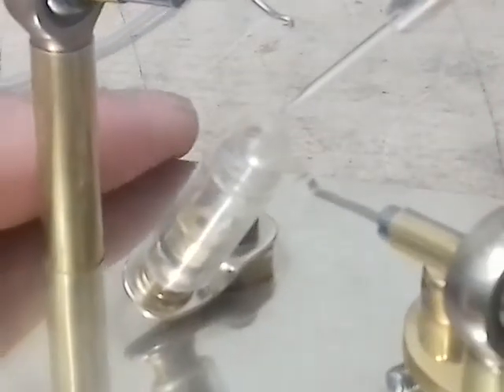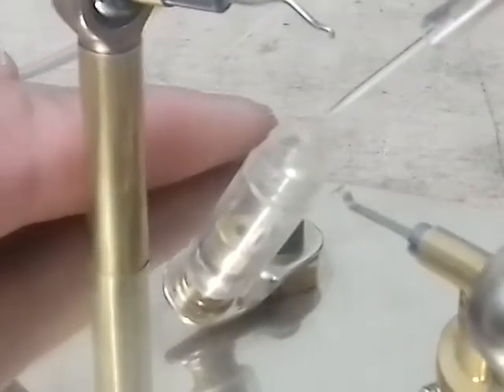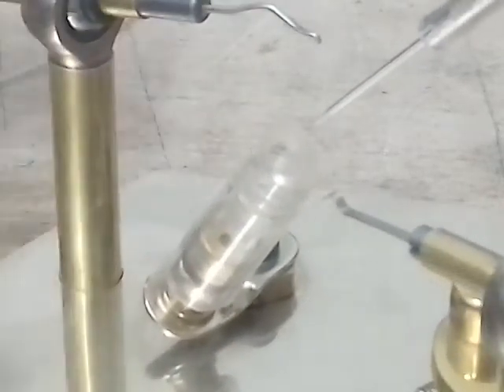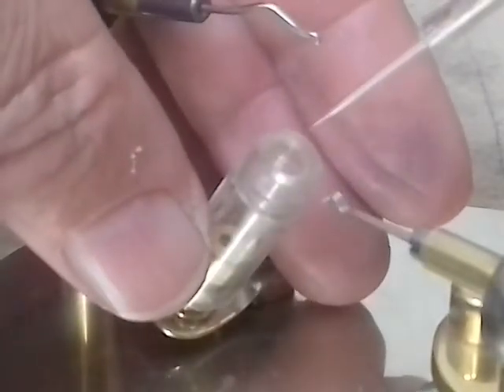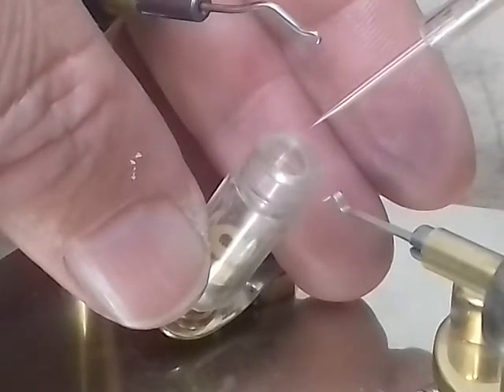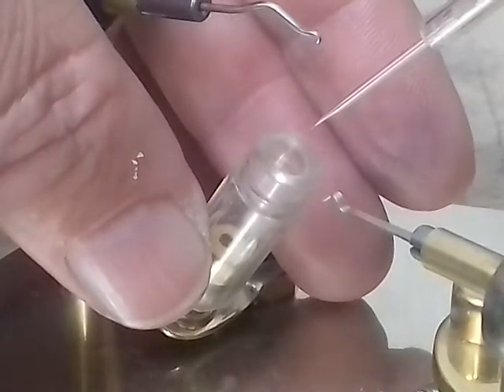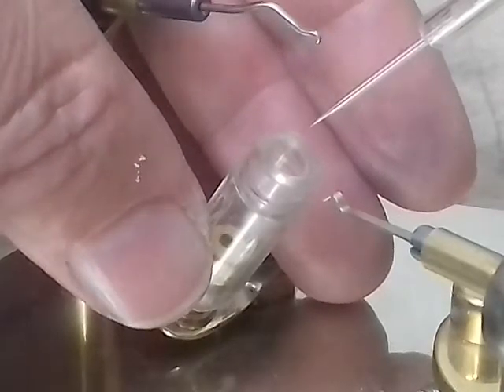This one works very well actually. I'm quietly surprised, even with the fancy one with all the electric motors and things on. This one knocks the socks off it really. As you can see there, the movements of the needle are so precise. That's lateral movement and that's vertical movement. And it's so user friendly actually, it works very well.